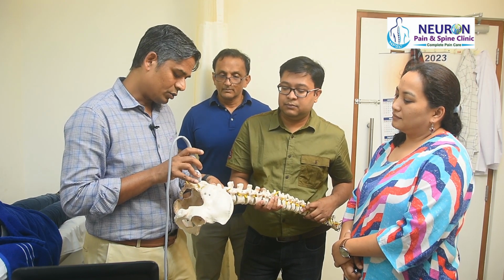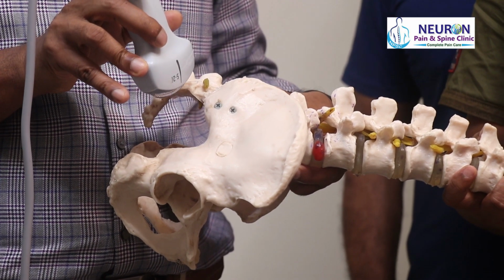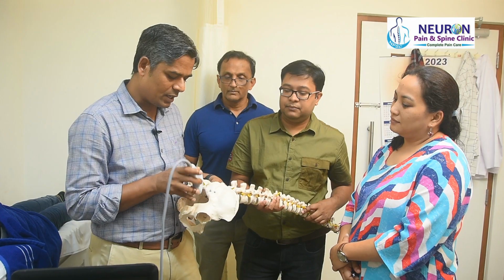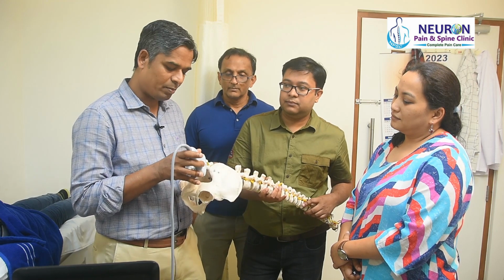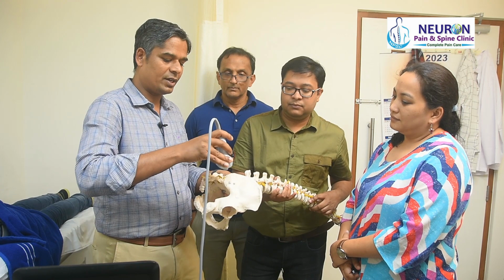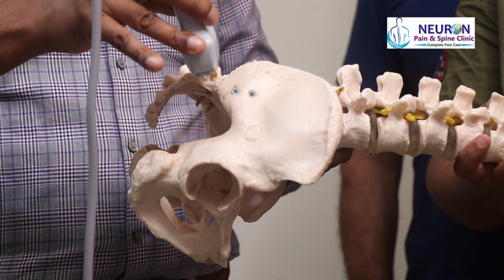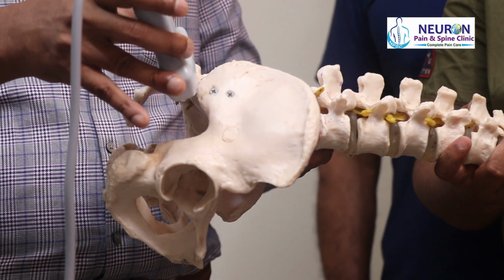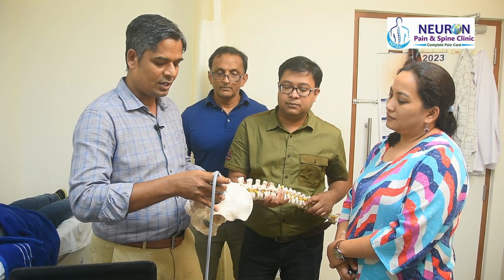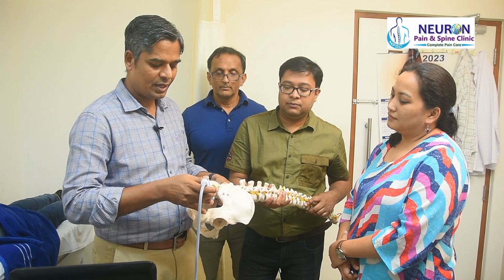This is very important. I move my probe slightly lateral, a little oblique, in order to orient in the direction of the piriformis muscle, and then I do a certain heel-toe maneuver, look in, so that the whole of my ultrasound beam goes into the pelvis. So from here, in this plane, once I reach here, go lateral, slightly oblique, look in. These are the three things that I need to do so that I can see the piriformis muscle very well. In this plane, I go further inferior till I reach the ischial spine.